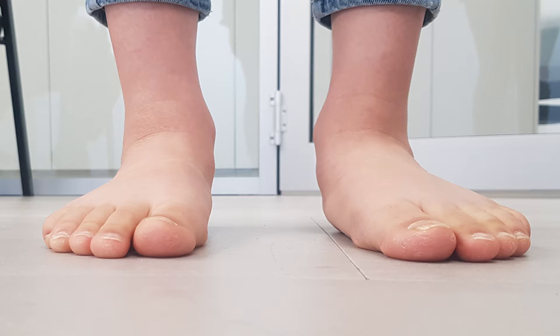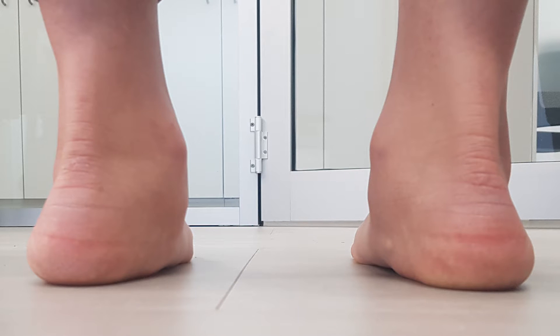I've put some images up of her in static stance. You can see the inverted calcaneus, the drop in the longitudinal arch. Not a lot of forefoot abduction.